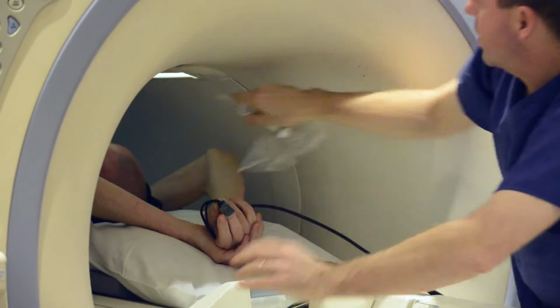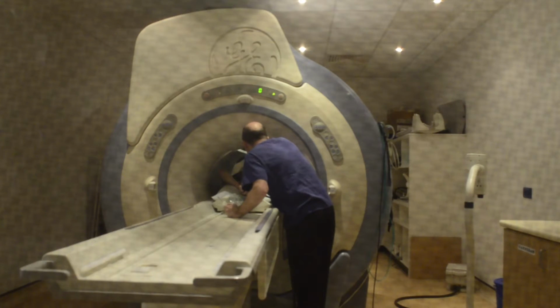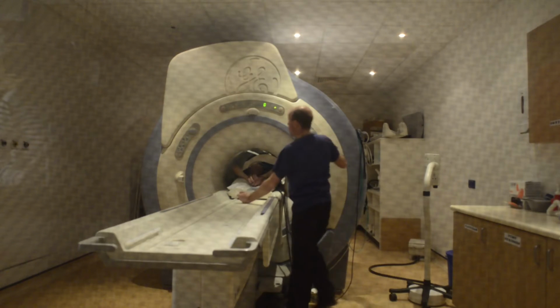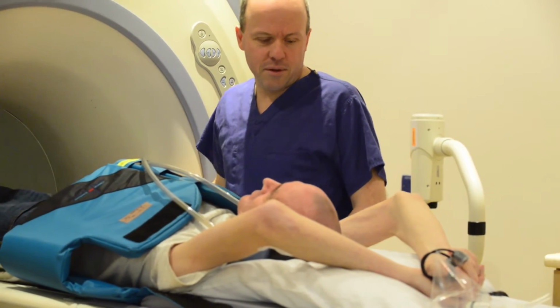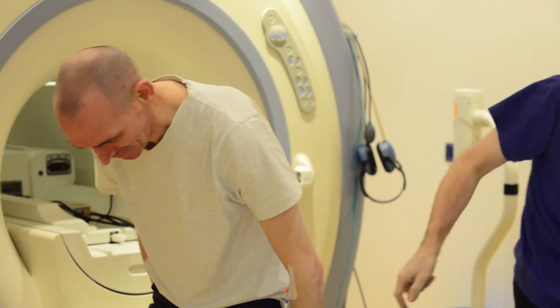There are some side effects of the xenon gas, and we always explain these to our participants. The most common are that it gives you a deep voice, so you can sound like Barry White, and it also makes you feel a little bit lightheaded and dizzy, although that's quite a pleasant experience, and some patients have said it's like having a big gin and tonic. But all of these are very short-lived, so they only last for a few seconds, and then as soon as you breathe, those sort of feelings go away as well.